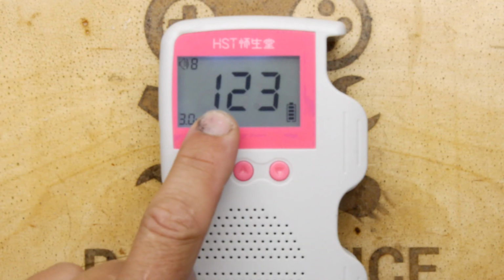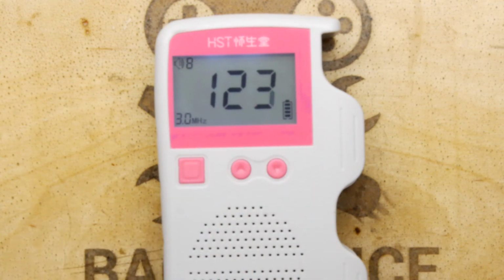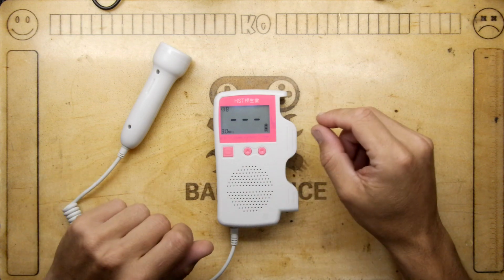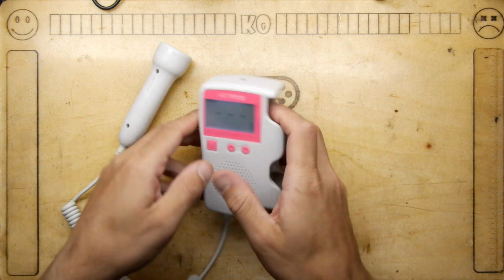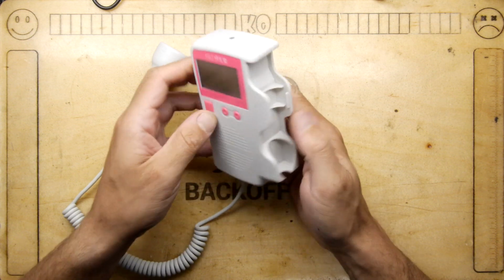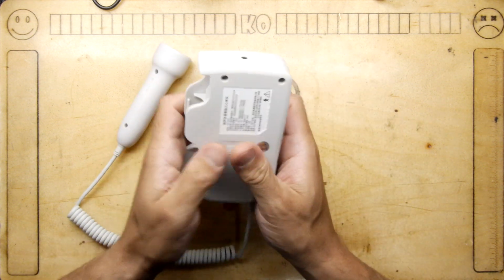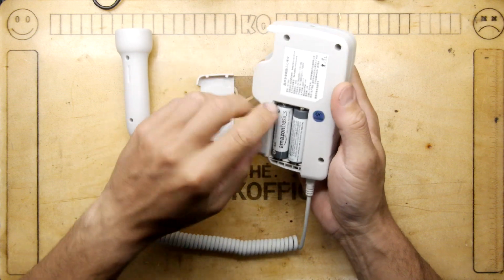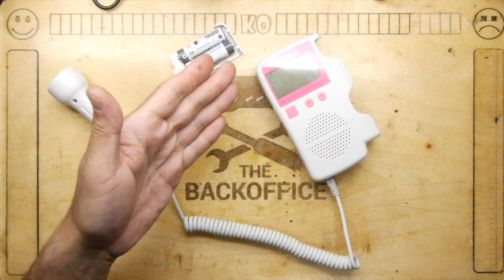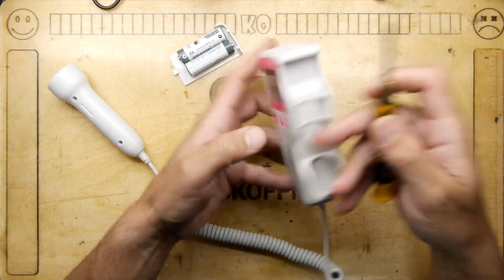So while you can see it says 123 on the gauge, that's supposed to be the beats per minute. I can assure you I'm not running at that frequency right now. So clearly this is designed to pick up the sound of a baby. Well, I say baby, maybe a baby's heart, but more like a fetus's heart. And that's what it would be calibrated for, and that's why it's reading this strange number.